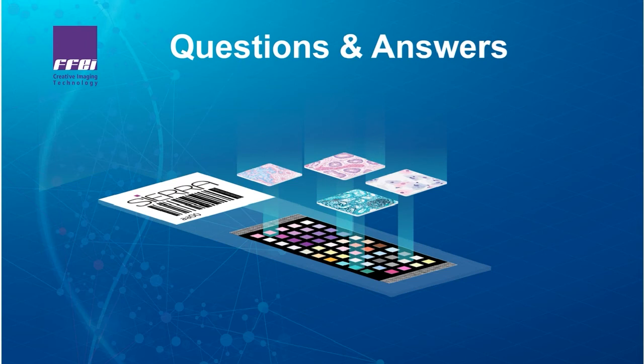Okay, and then what are the implications for not colour calibrating my portfolio of scanners? Okay, great question. I'll take that. Obviously, calibration is all about bringing standardization. So if you're not calibrating a device in your workflow, you're not sure necessarily where it is in terms of how it's interpreting color. So at a practical level, that means that if you've got the same sample and you're scanning it on two different devices that are not calibrated, then you're going to get different results. What this technology does is unify the capability and how the color fidelity of the image is captured and then replayed. So if you calibrate, you have much more confidence that the same sample on different devices is going to look the same on screen. Thank you.